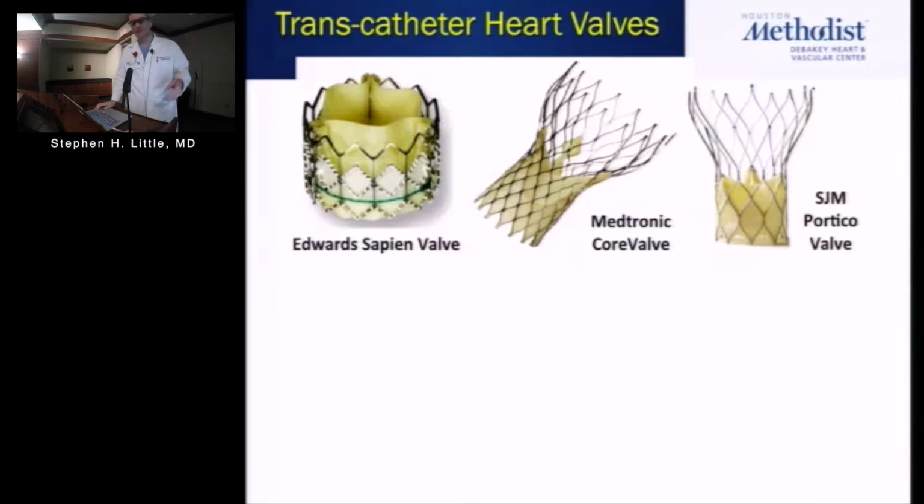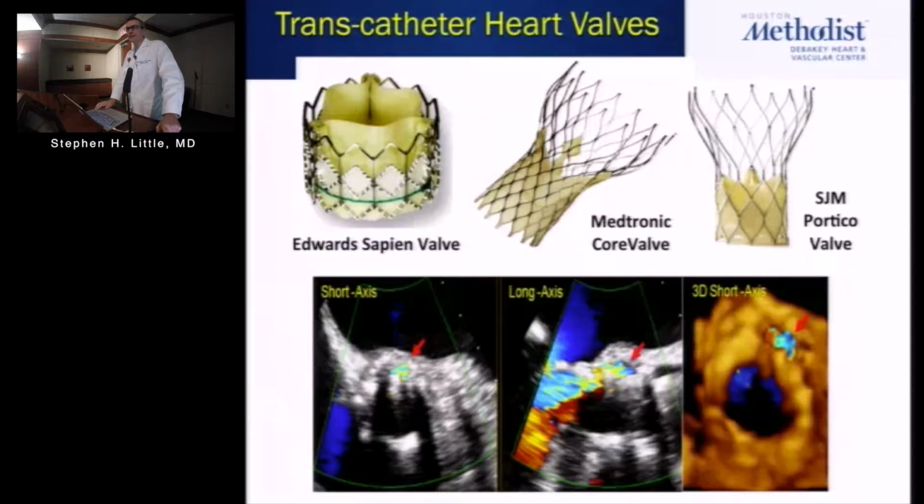So you've seen these slides before, transcatheter heart valve. We do a lot of this stuff. 3D echo can be very useful during the procedure if there's complications, particularly for paravalvular leak. But you all know we don't routinely do 3D TE at all now during our TAVRs. During our learning curve, we certainly depended on it, but increasingly we go with fluoro and with our operator experience. But when there's trouble, they still put the probe in. Anesthesia does their best, and when they're stuck, they call us.